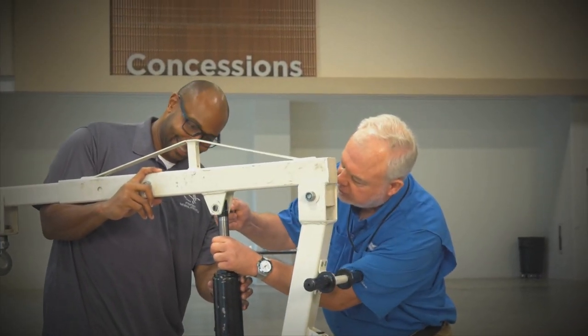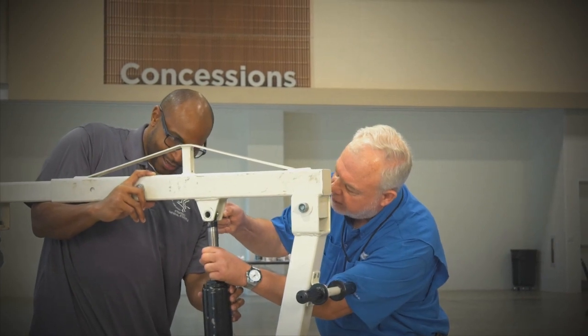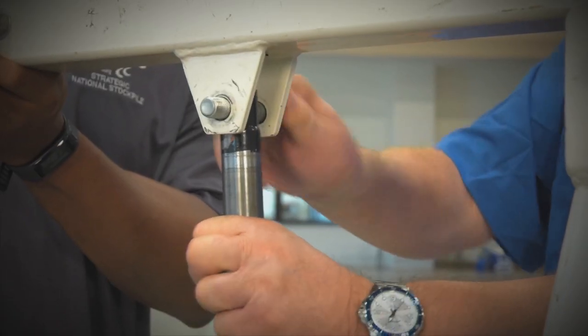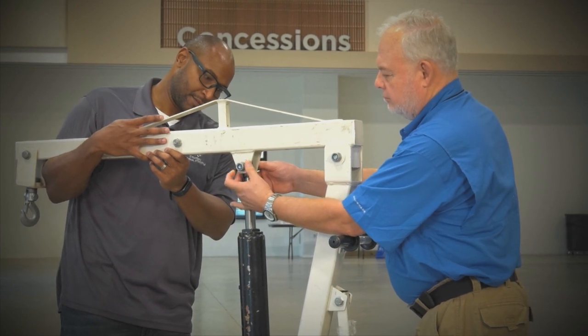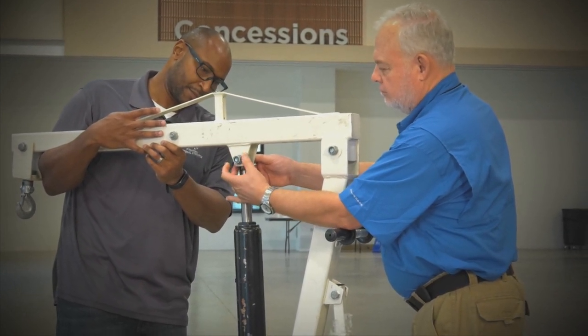Attach the top of the hydraulic lift unit to the extension arm bracket. This also requires at least two people, as this section of the lift is very heavy and must be held in place while tightening the bolt.